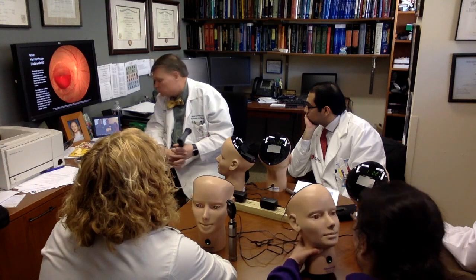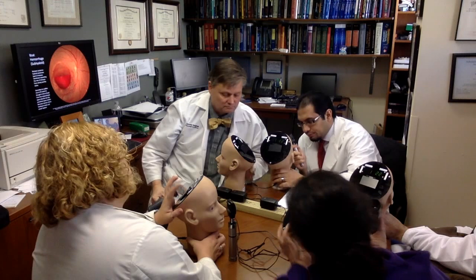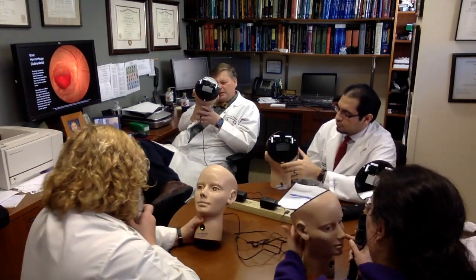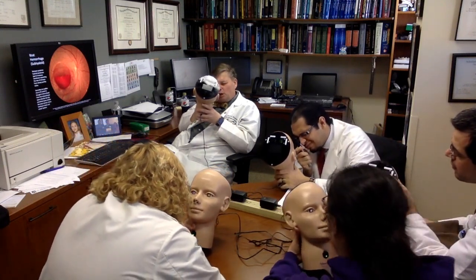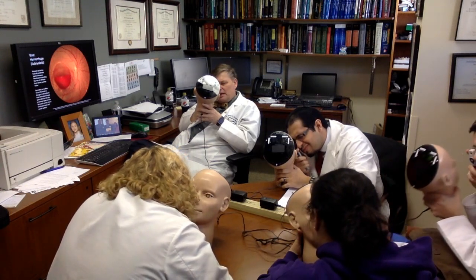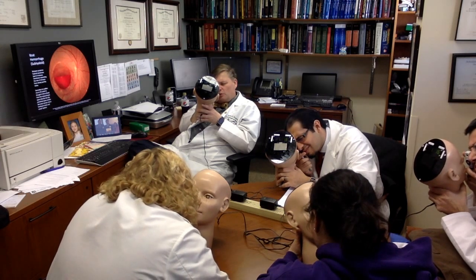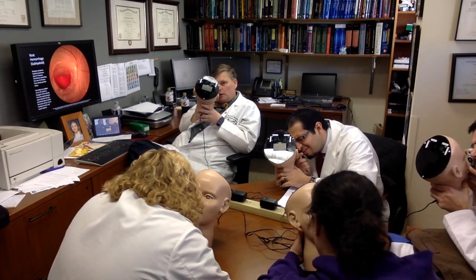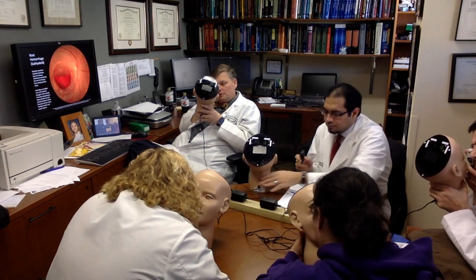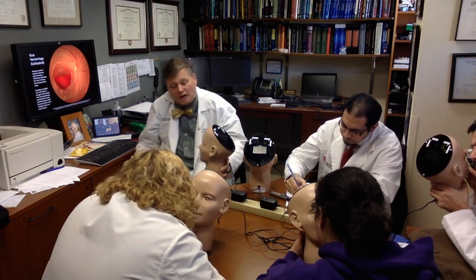Okay. Let's go back to number 16. We'll focus at a distance, and we're going to come in. This one, you're not going to see the disc. This is actually a blow-up. Come in till you start to see the retina and some vessels, and then focus in. Now, what do you think about the color of the retina? Pale. It's really pale. But do you see this bright red dot in the middle? Okay, what do you think this is going to be? Good. So this is central retinal artery occlusion.